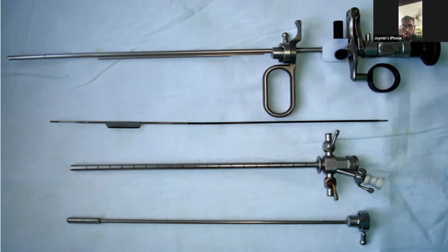So describe now the VIU sheath. It is in front of you. The VIU sheath, sir, is a standard 21 French sheath, which has markings along the entire sheath length at 1 centimeter. That is mainly to calculate the length of the stricture. The beak of the sheath is straight oval in shape, sir. It is not like the cystoscopic sheath. So don't say beak. Say the distal end. Okay, the distal end doesn't have a beak. Yes, sir.